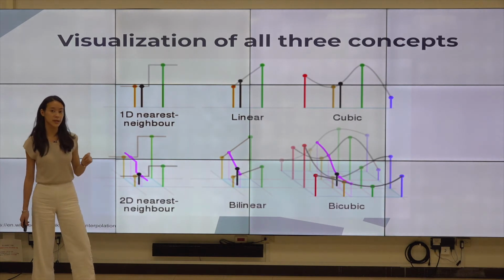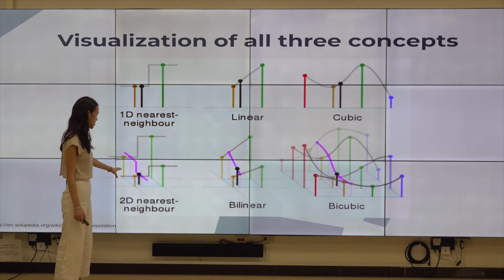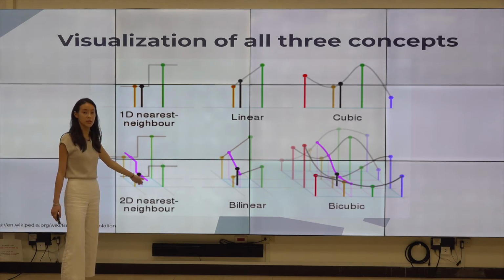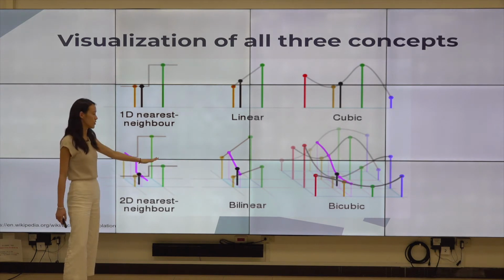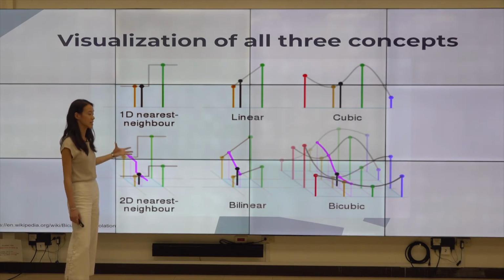So going on to talking about the visualization, as I was talking about before, there's a reason why the images become more pixelated, as we can see in this situation. It is blocky because you're taking a step up from each step. So there's no data in between these two. As I said before, this may be 0 and 1. There's no data between that 0 and 1. So there would be some kind of unknown data between these two, which makes the entire image more pixelated.